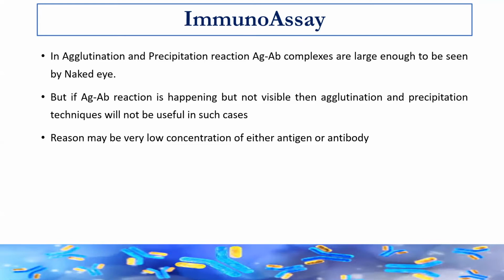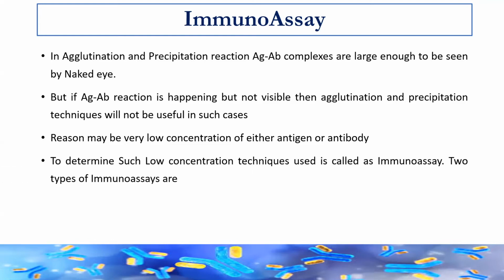In such cases, you need an advanced technique to quantify antigen or antibody at a lower concentration. To determine such a low concentration, the techniques used are immunoassays.